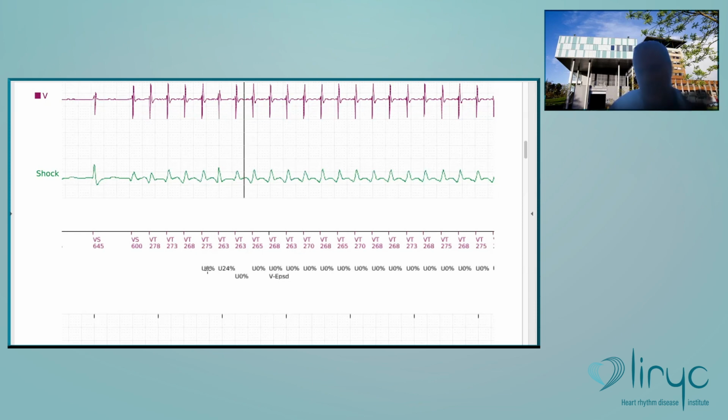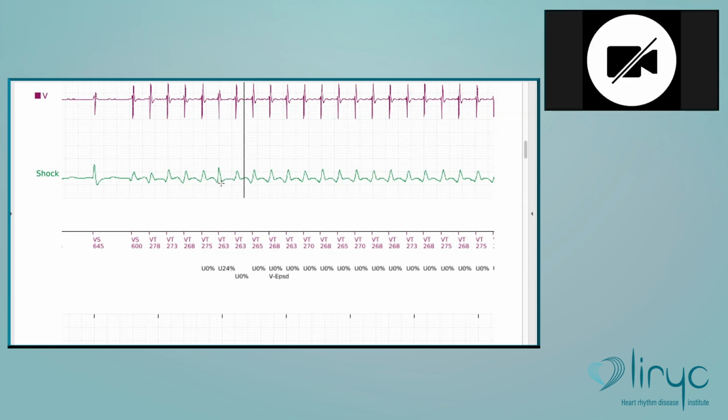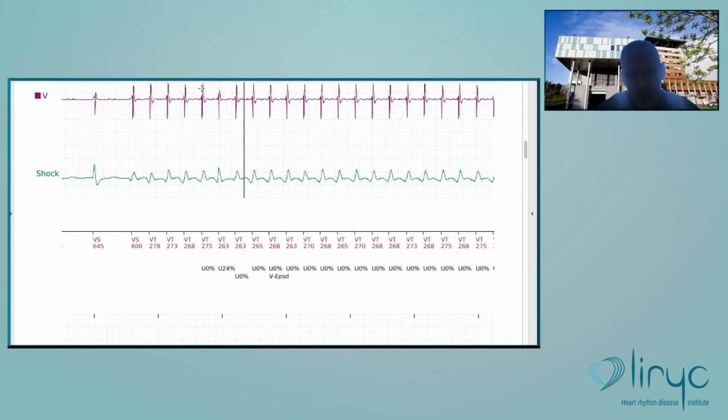C is when it's correlated. So if the value is more than the threshold that you have programmed, more than 94%, it's going to be a C. But here you see obviously no correlation. You see here the sinus rhythm, and then on which signal is it analyzed? Which channel? The shock channel. Yes, it's based on the shock channel, but there is also an alignment with the bipolar one. So both of these signals are used. This one is used for alignment here, and then from this alignment, you analyze this signal with analysis of 8 points.